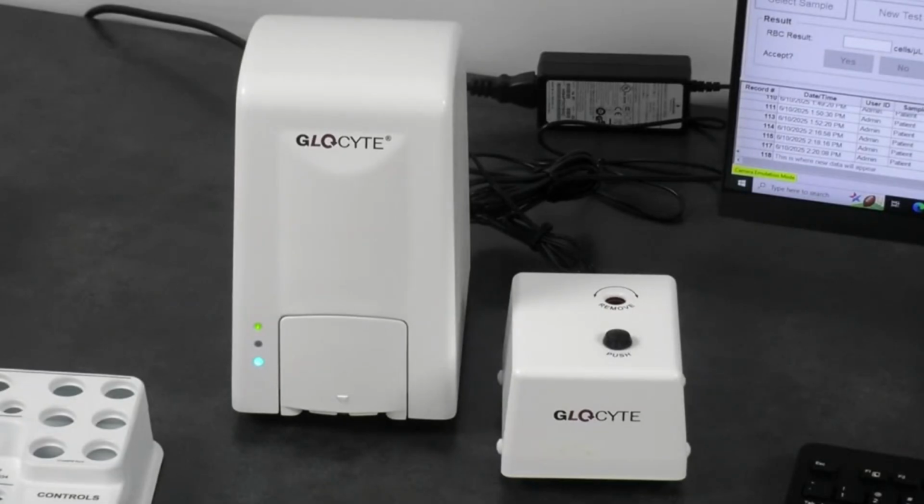I believe it is around 5,000 TNCs per microliter, or sorry, WCs per microliter, and much higher for the red cells, but we can get that information and circulate it. Definitely. Thank you, Julie. We could definitely follow up with you, Nicole, and get you the AMR for it.